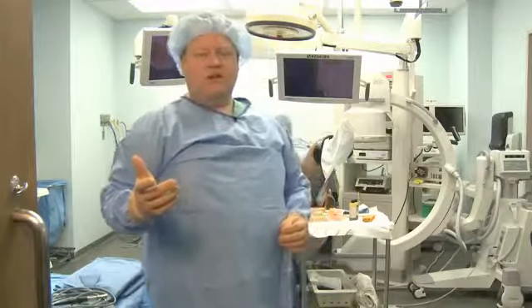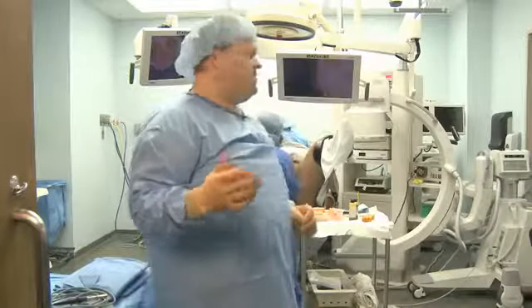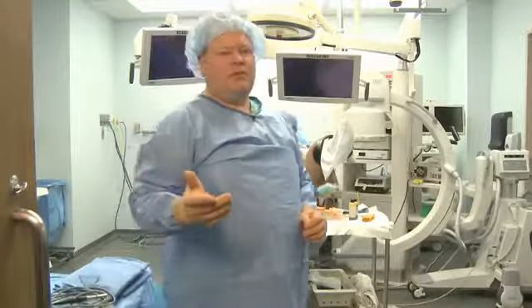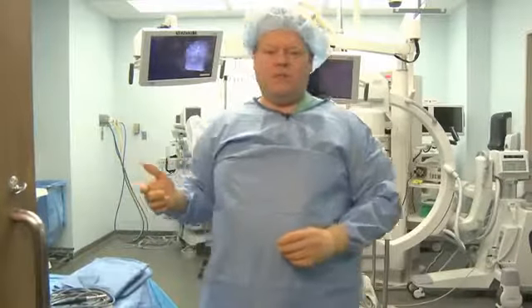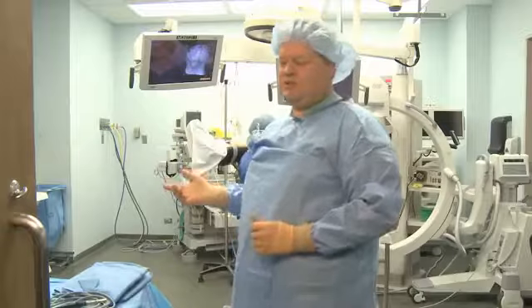We don't utilize fluoro or any other imaging for this procedure, so a lot of times we move the C-arm out of the way. Makes it easier to move the patient on and off the table. They're not hitting their heads on the equipment. So we're going to go ahead and get started with this in just a minute. Again, it's a patient with prostate cancer who has gross hematuria.